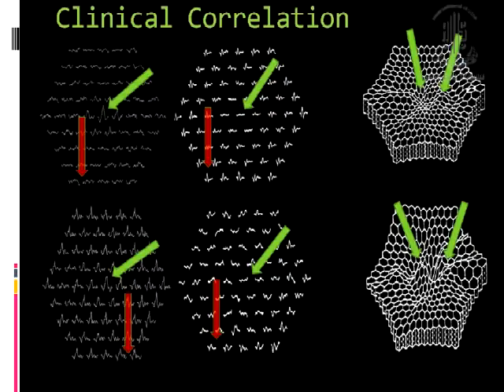Here, the opposite problem, you can see that the central is pretty much lower, and topographically the 3D representation also can show multiple islands of depression. But of course it's not bad enough to say that this is a total depression. The one on top, you can see that it's almost flat in the center and also represented here in the 3D representation. So this could be coming from the same patient a few months apart, and you can see the progression, how it goes.